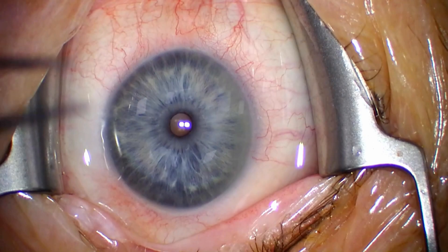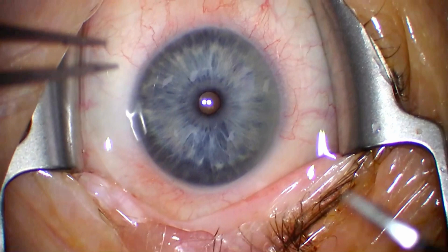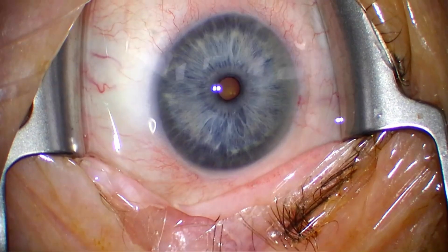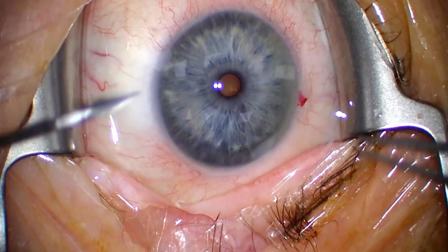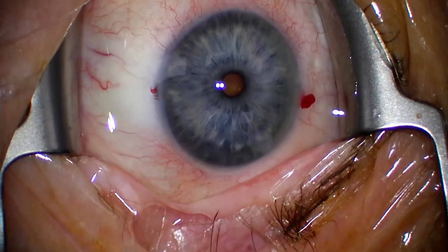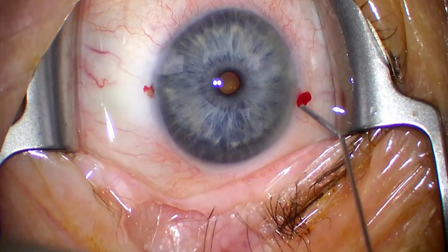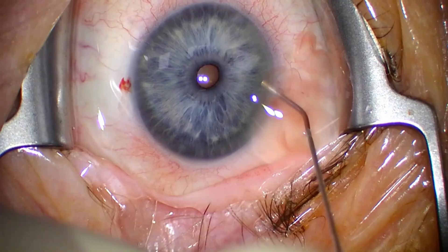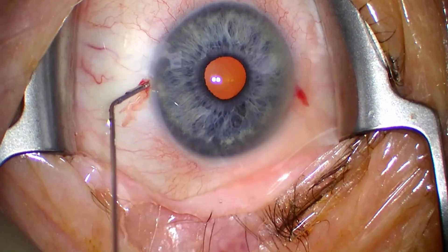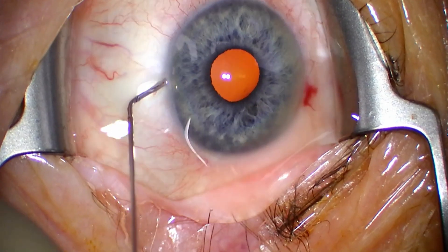Here we have a small pupil, floppy iris case. You can see the pupil is really small — I was probably ahead of schedule so the drops didn't really do much yet. Here I'm injecting some midraine — that is tropicamide, phenylephrine and lidocaine.